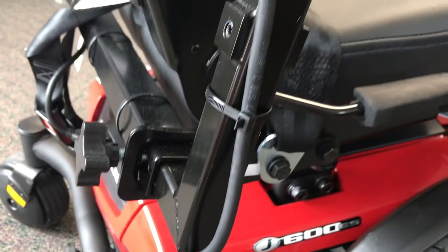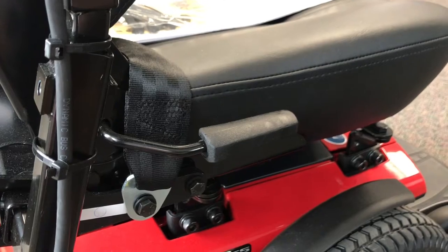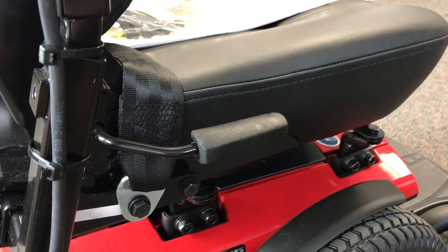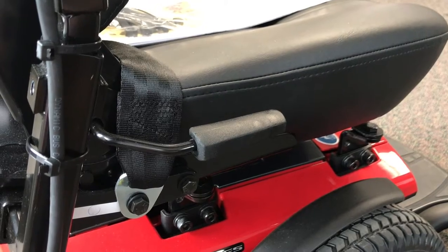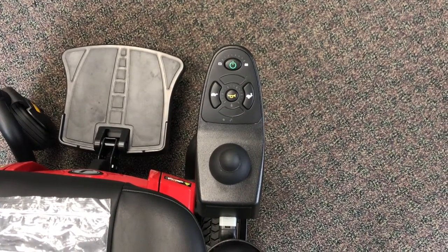There is a small black handle at the back of the seat on the corner. If you pull that handle up, it reclines the backrest just like a car seat. So pull that handle up and you can adjust the seat for your level of comfort.